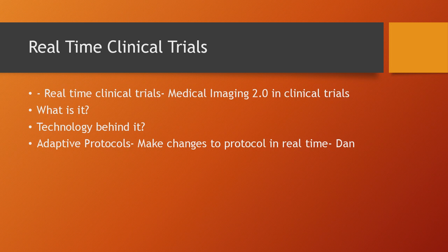And this space is private for the clinical trial, and then the hospitals and the centers for this specific trial can upload the studies there. And we give all the user accounts and access. In our company, we have the centralized quality check of all the examinations that are uploaded to the clinical trial.